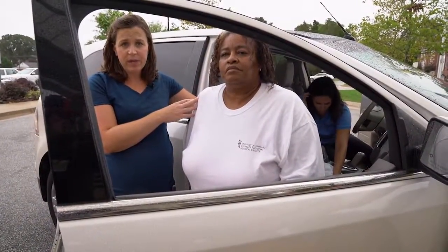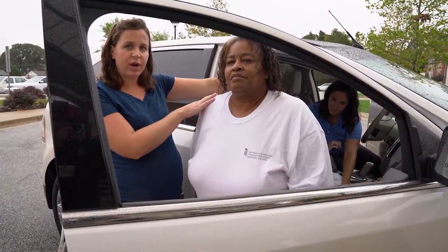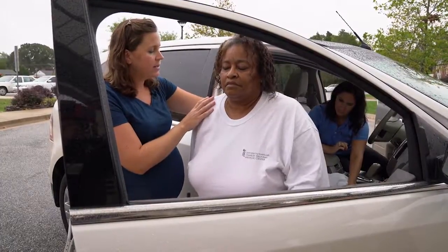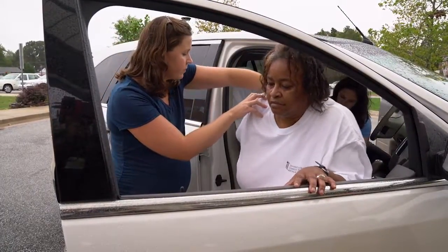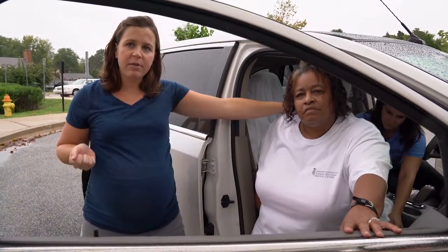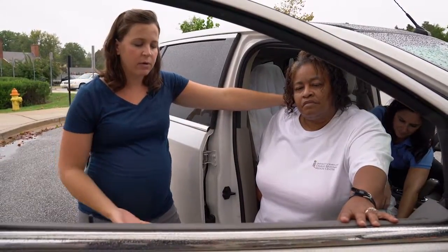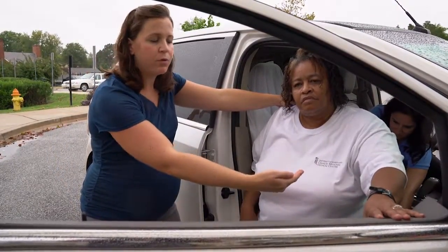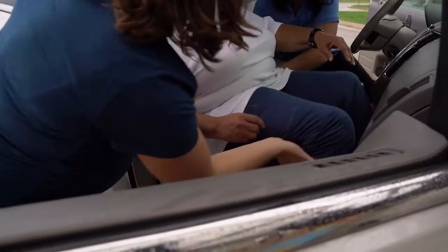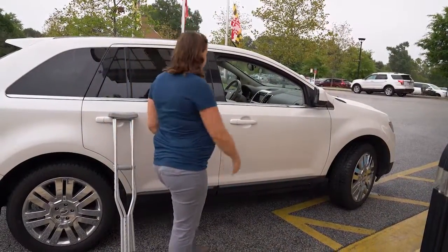If you have two people to assist you in getting into the car, have a person over on the driver's side and have a person over by your family member. Go ahead and sit on down for me. The person over on the driver's side can grab the sheet that your family member is sitting on, while the person on the outside of the vehicle can help grab the legs and move them in. On the count of 3. 1, 2, 3.